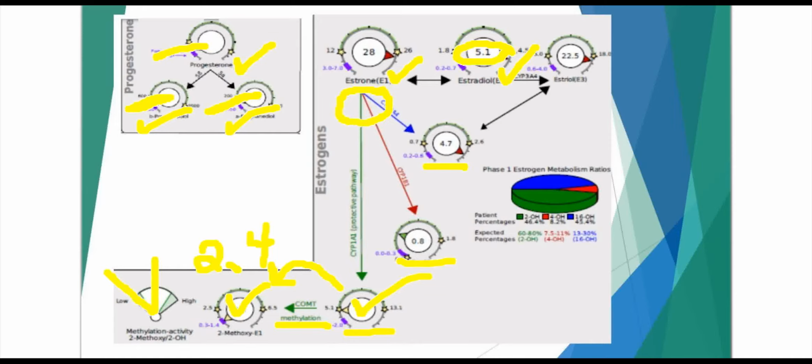And then if you look back on page 1, what you'll see is progesterone listed as a serum equivalent. There we've taken all of the correlation data that we've accumulated, which is quite impressive, and we've been able to predict what a serum progesterone may be in this particular case. So you can look at that value and you can look at these 2 metabolites to get an idea of how much progesterone is the patient making.